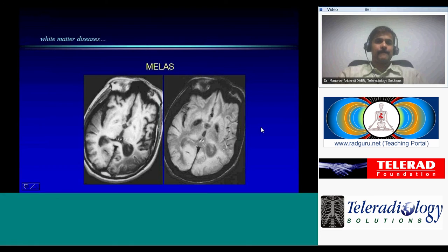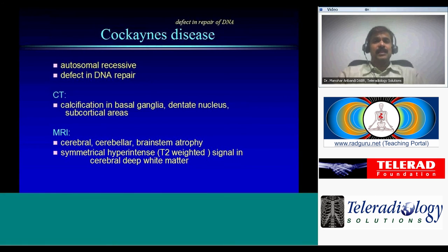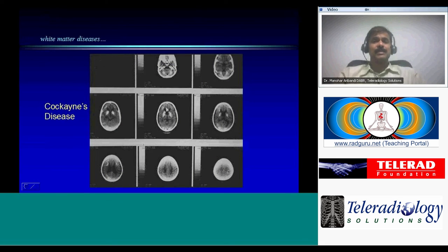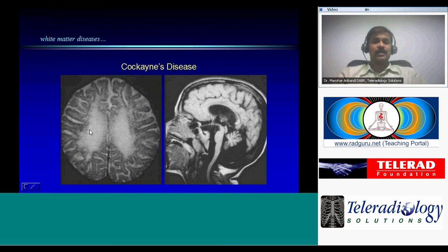Cockayne's disease is caused by a defect in DNA repair and is autosomal recessive. On CT, calcification is seen in the basal ganglia, dentate nucleus, and subcortical areas — another demyelinating disease associated with calcifications. On MRI, there is cerebral, cerebellar, and brainstem atrophy, with symmetric hyperintense signal in the cerebral deep white matter due to demyelination. Imaging shows extensive calcification in the cerebellum, basal ganglia, and subcortical white matter, along with demyelination in the cerebral hemispheres and cerebellar hypoplasia on sagittal views.